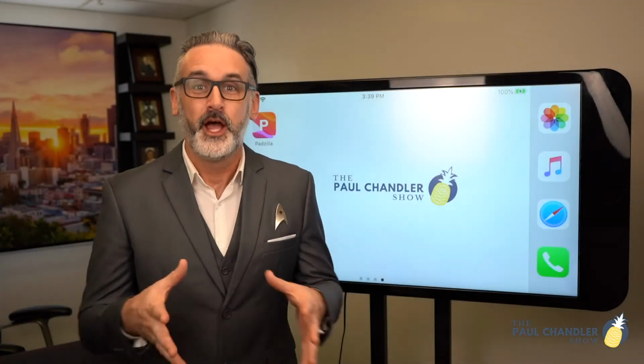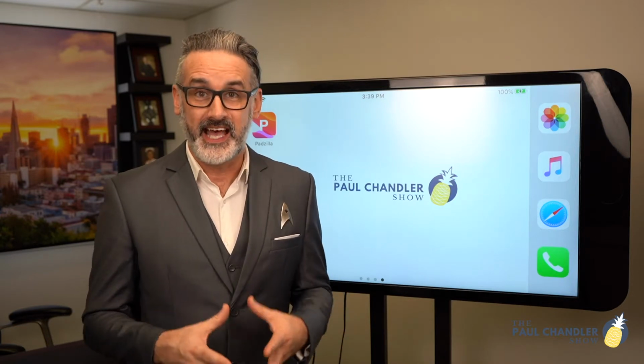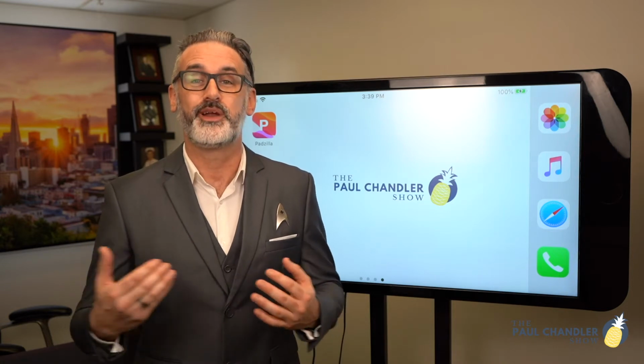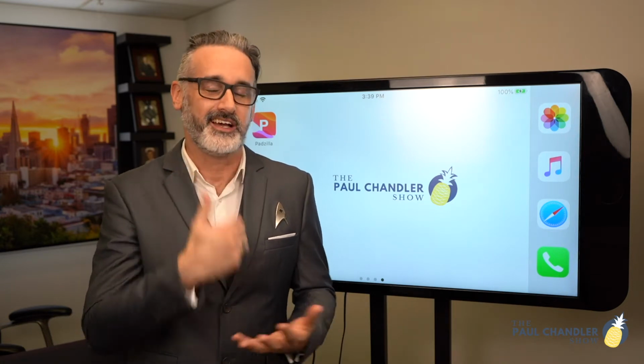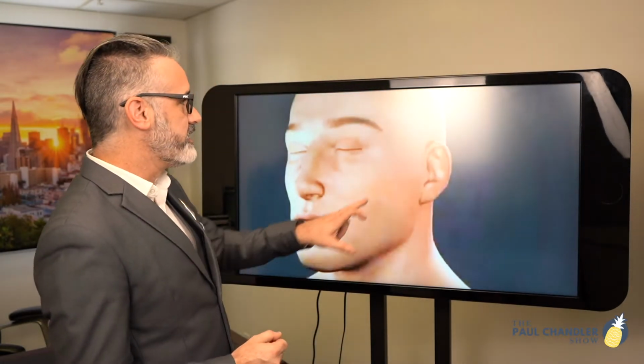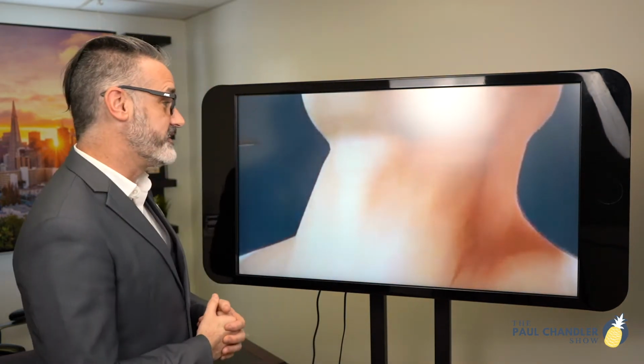Welcome back, everyone. So in tonight's episode, we're using the Padzilla again, and we'll be looking at a tracheotomy procedure being performed. So breaking down that term, tracheotomy, we have the prefix trachea for the trachea, and otomy, a temporary incision. So during the tracheotomy, to be able to get to the trachea itself, the provider has to do many incisions to get through several different layers.